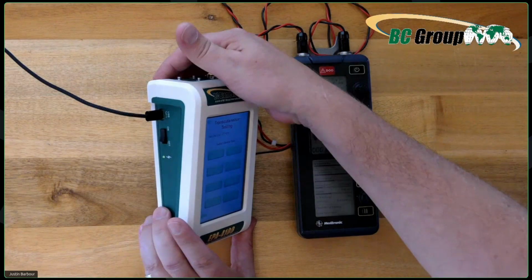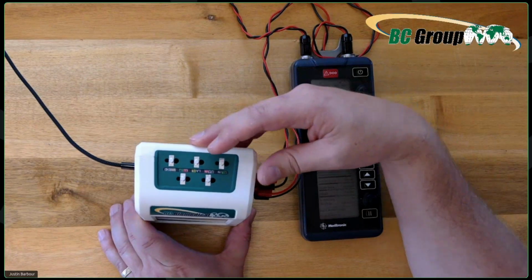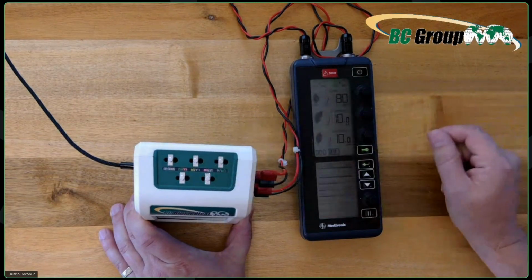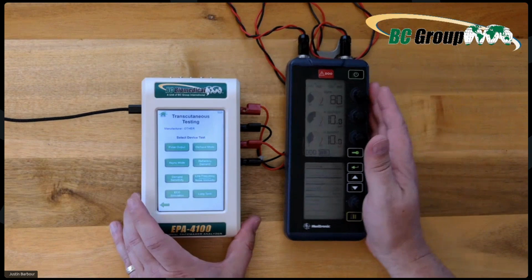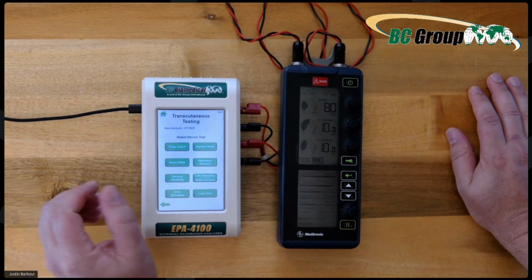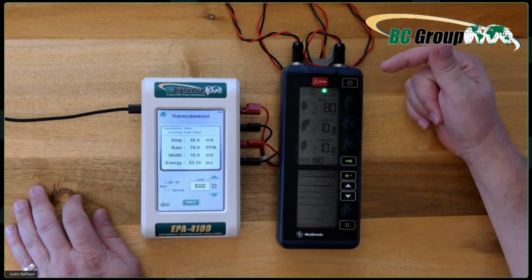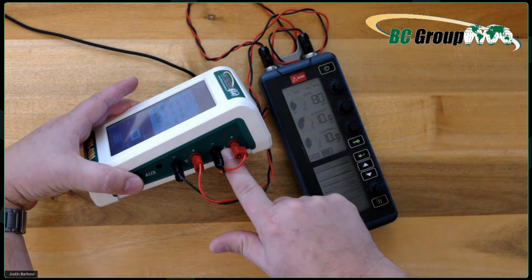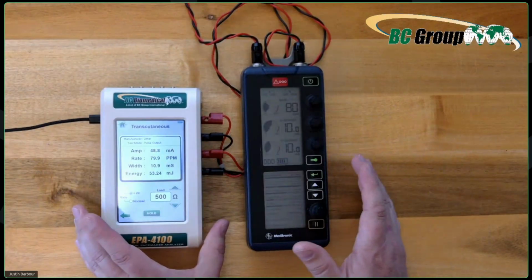We have a power switch on this side along with USB-C for charging and data. And on the back side, we have our ECG snaps. We got banana plugs of 2 different sizes, and we got low profile stainless snaps there. So you can connect ECG for testing and other things, which is found down here. Let's go ahead and go into pulse. And we're currently pulsing on A and B. And I want you guys to take notice, right here are those flashing LEDs that I just mentioned. So I won't have to show you that anymore.